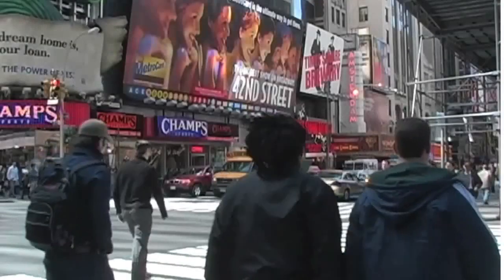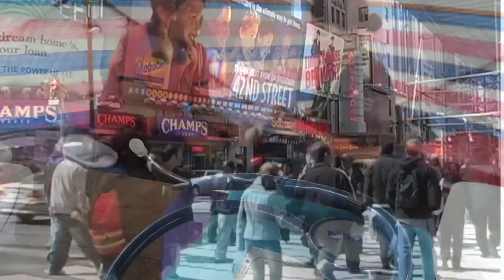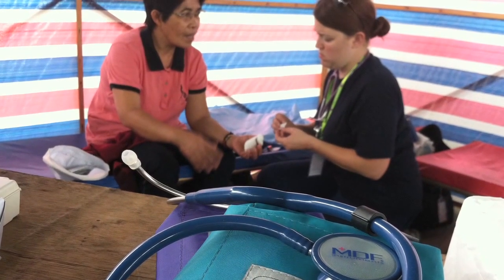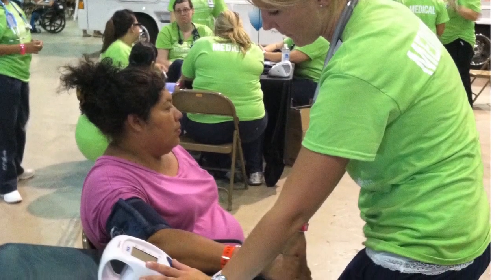The reason why all of this is so important is our common goal to battle the hypertension epidemic. About one in four Americans has high blood pressure, but what's even worse is that over 50% don't even know it. These statistics are concerning when you consider that high blood pressure is easy to diagnose and treat, and particularly alarming because hypertension is one of the most preventable causes of heart disease globally — causing 17 million deaths every year. So after learning of these statistics, we asked ourselves: how can we help solve this problem globally?